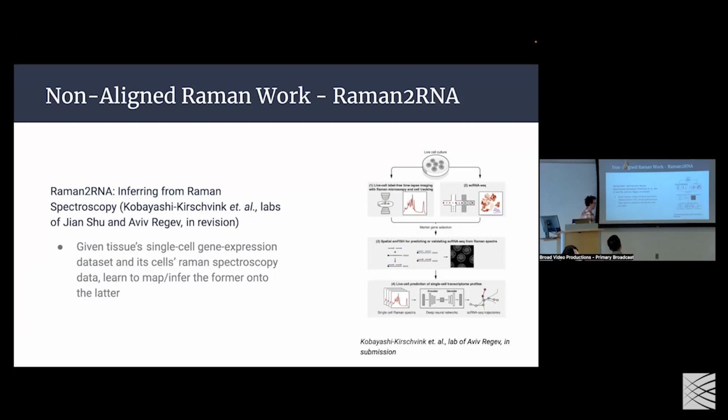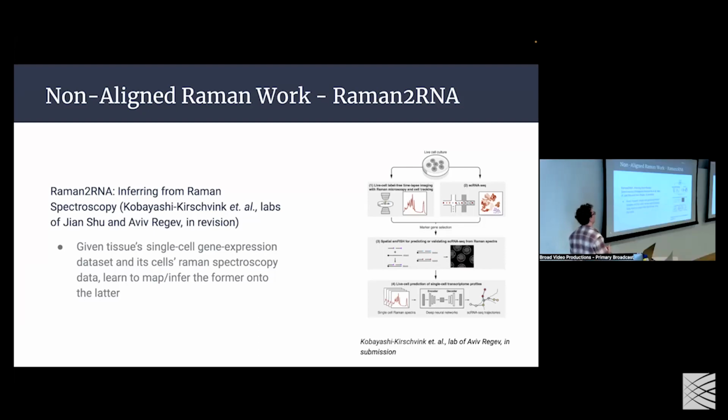Very smart guy, very nice guy. He developed this framework called Raman to RNA, which is more or less like SHAF, but dealing with Raman spectroscopy instead of histology images. What is the difference here? Raman spectroscopy is roughly a 900 dimensional image, I put in quotation marks, a very high dimensional imaging modality that is more informative than histology stains in a lot of ways. And we wanted to see, can we go from Raman of a biological system to transcriptomics?